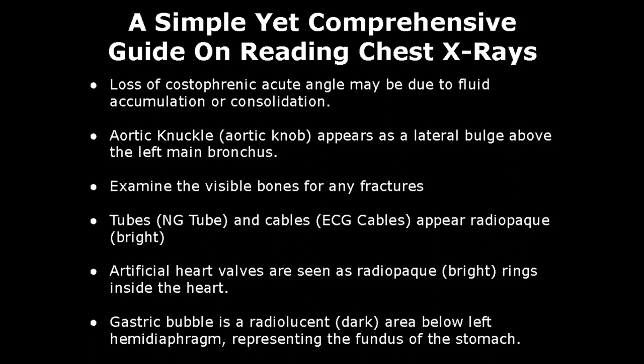You must check all the bones on the chest X-ray for any fracture. Tubes such as NG tubes and cables such as ECG cables will appear radiopaque, that is, they will appear bright. The artificial heart valves will also appear bright, they will appear as radiopaque rings. And finally, the gastric bubble, which will appear as a dark area below the left hemidiaphragm. A radiolucent area below the left hemidiaphragm represents the fundus of the stomach.